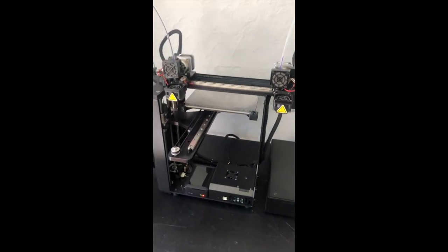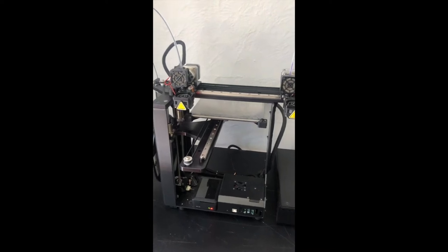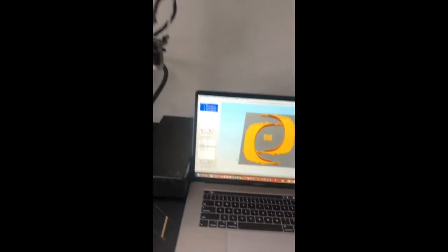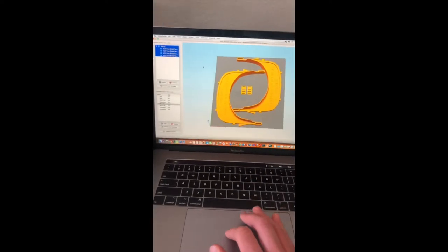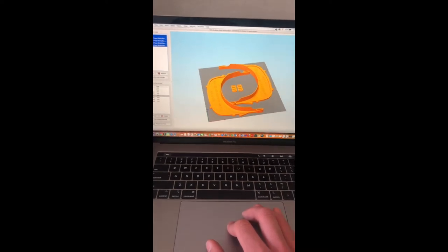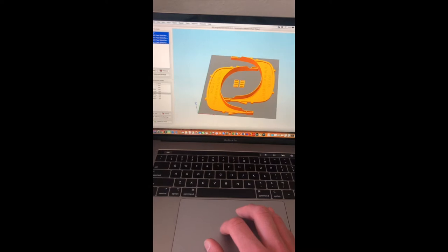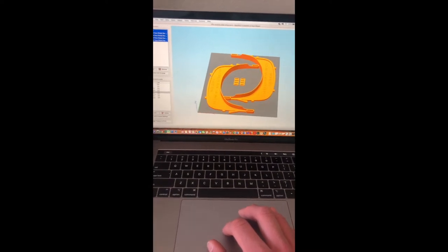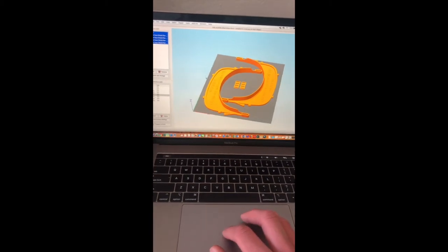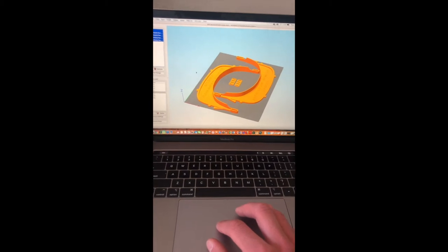I'll be using a MakerGear M3 independent dual to 3D print these face shields. But before I can do any of that, the first thing I need to do is tell the machine what I want it to print. So I have my 3D files here, which I've downloaded from the National Institute of Health. They have a website called the 3D Print Exchange, put together to enable anybody with access to a 3D printer to help make as much PPE as possible and provide it to local healthcare workers.